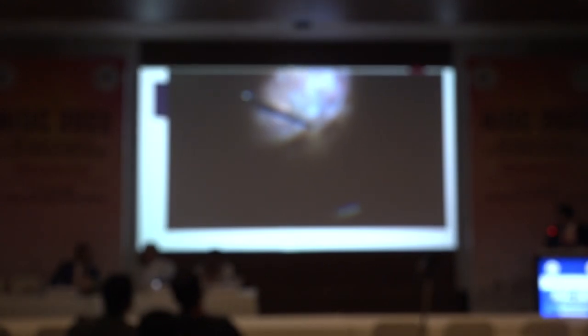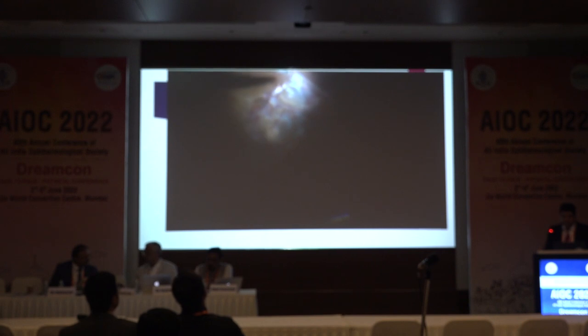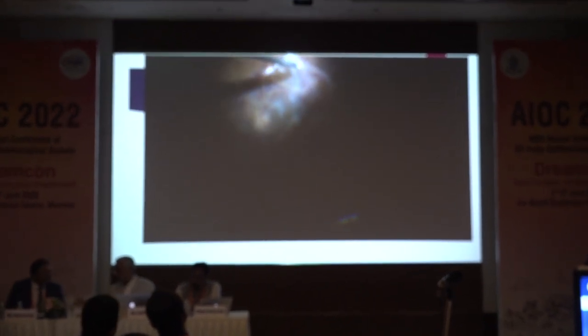And it's very difficult, with the help of only a cutter, to remove each and every attachment. And we are trying to prevent iatrogenic breaks. We can see that the retina is very ischemic, so any manipulation can lead to more breaks, which we don't want in diabetic cases at least. This time we have planned to shift to a bimanual technique.